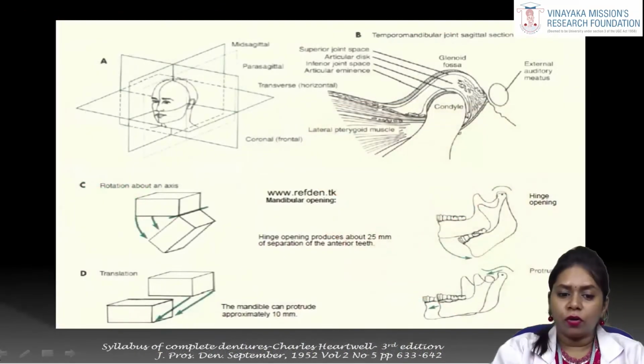So the movement of the tooth or the teeth results in the rotation and sliding movement of the condyle. The better the cast on the articulator duplicates the distance to the rotational condylar centers, the less is the potential of errors that are produced by differences in the arc of closure of the mandible and the articulator itself.